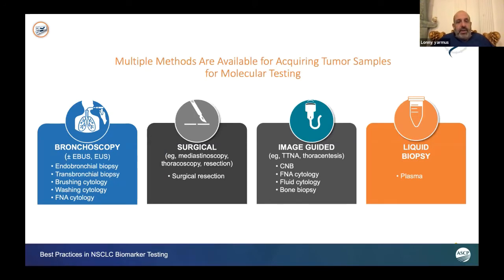The prior gold standard was mediastinoscopy, or surgical mediastinoscopy, which is also well known. One of the advantages of EBUS, there are many, but one of the main advantages is the safety profile and access, and the minimally invasive nature of the procedure when you compare it to something like mediastinoscopy.